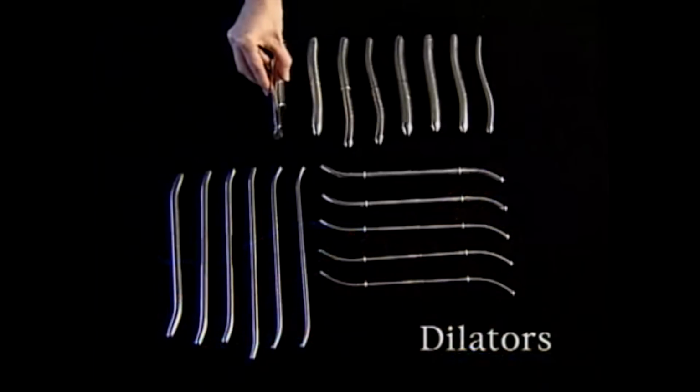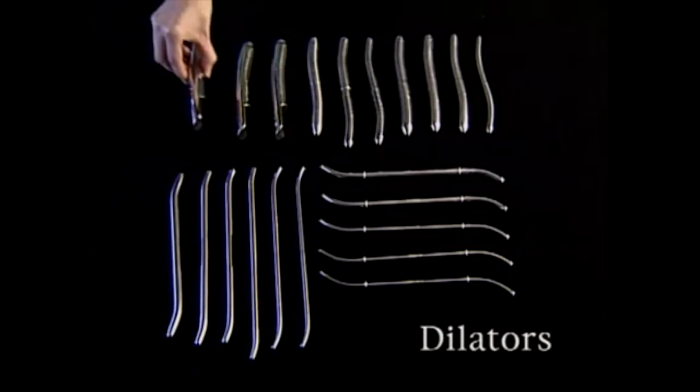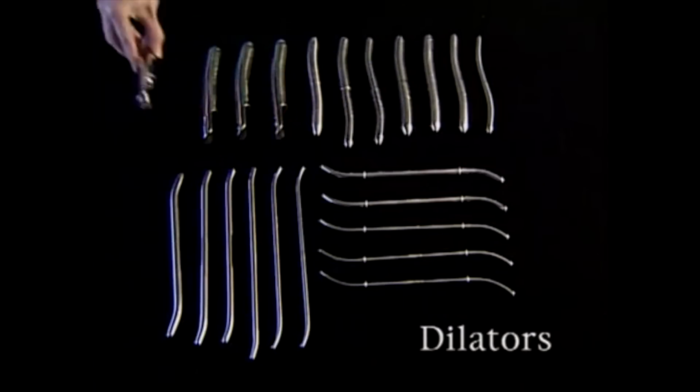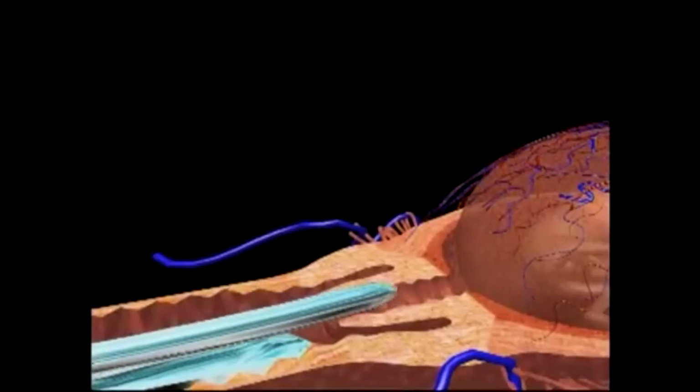In order to accommodate the instruments necessary to continue the abortion, the cervical opening is then enlarged through the use of cervical dilators. These dilators come in a range of sizes, and progressively larger ones are used to achieve greater dilation. In the procedure depicted here, two sizes are being used.